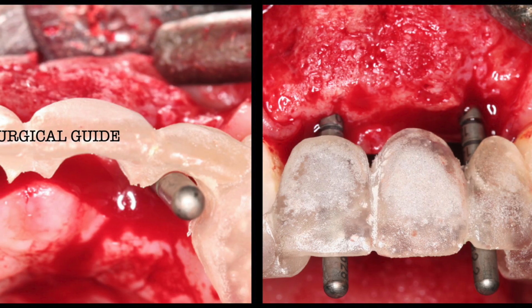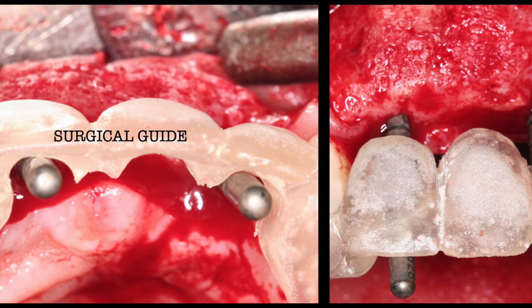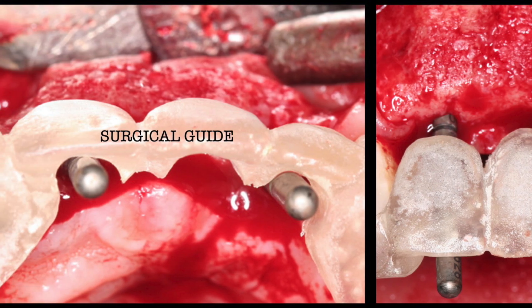Using surgical guides will help you place an implant in a more precise location. Guided surgery will allow you to be more precise with placement. When doing multiple units or full mouth rehabs, a surgical guide should be mandatory for precise implant placement.